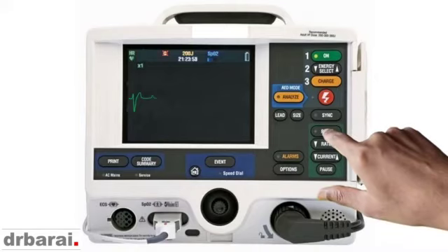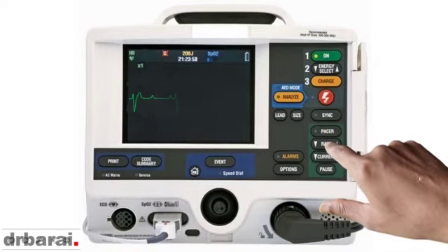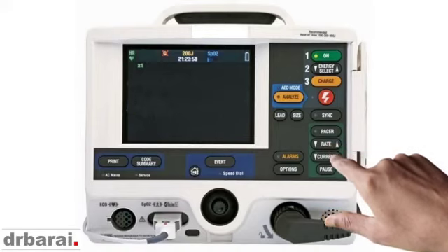In transcutaneous pacing, we will press the pacing button here, and then we need to set a rate. Usually I set a rate of about 70 beats per minute, and then I increase the current, starting with maybe 10 milliamps, then increasing in increments of 10 milliamps: 10, 20, 30, 40, 50, 60, 70, until there is an electrical capture and a mechanical capture. The electrical capture will be demonstrated on this monitor, and the mechanical capture is the palpable pulse and a recordable blood pressure.